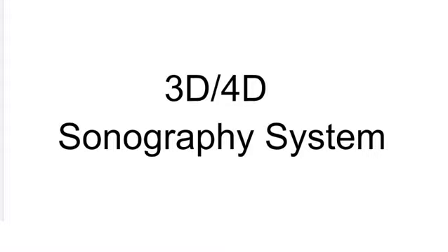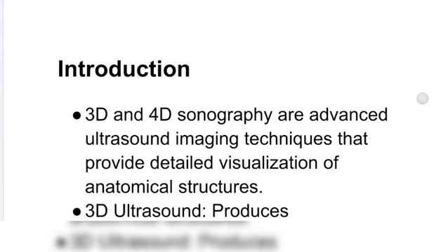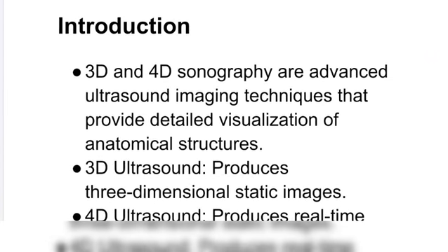Today we are going to discuss the topic 3D or 4D sonography system. First is the introduction. What is 3D and 4D sonography? 3D and 4D sonography are advanced ultrasound imaging techniques that provide us detailed visualization of the anatomical structures.